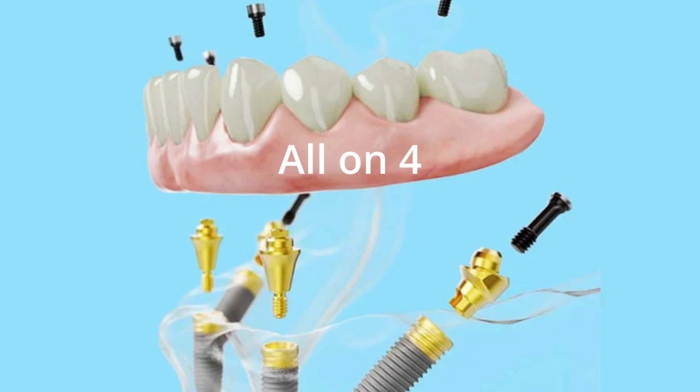However, cases with maxillary AllonX and mandibular removable dentures are relatively rare. They do exist, but they are not common. Typically, implants are placed in the mandible for AllonX, while a removable denture is used in the maxilla. But what happens when both arches are restored with fixed prostheses? How much does occlusal force increase? Patients with parafunctional habits such as bruxism or clenching, or those with inherently strong chewing forces, continue chewing until bone resorbs or implants fracture. Am I the only one who thinks this way? Ultimately, occlusal loads exceed the implant's support capacity, peri-implant bone is destroyed, retaining screws loosen, and eventually the implant fractures. That is how they come back to us.